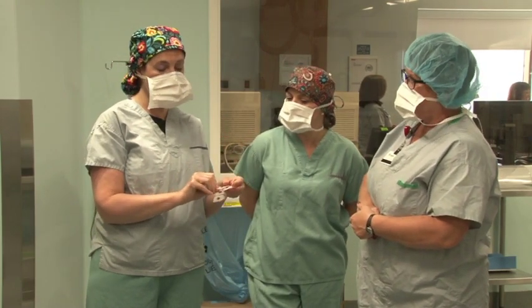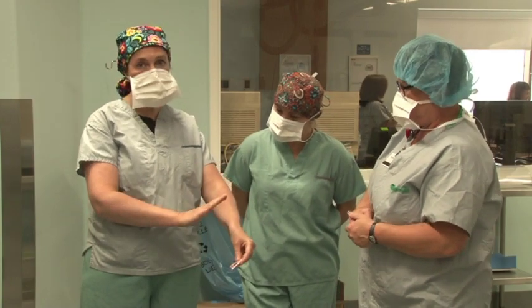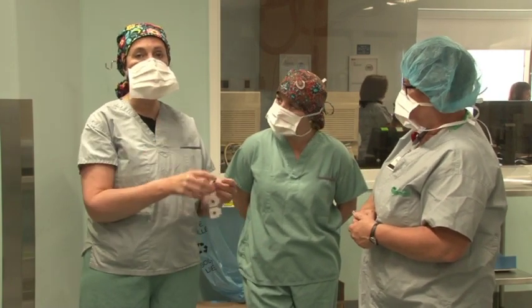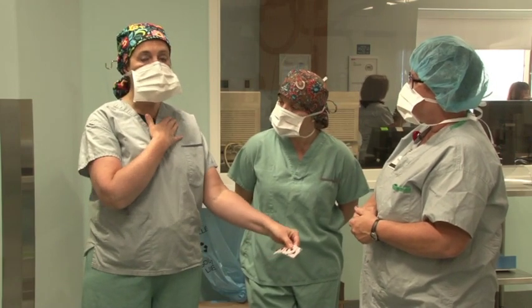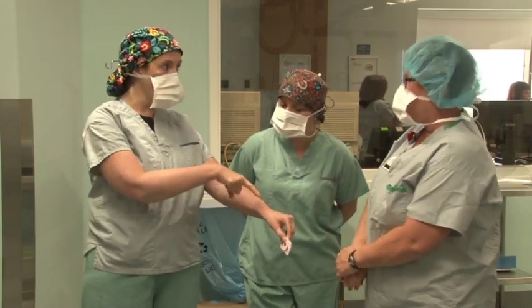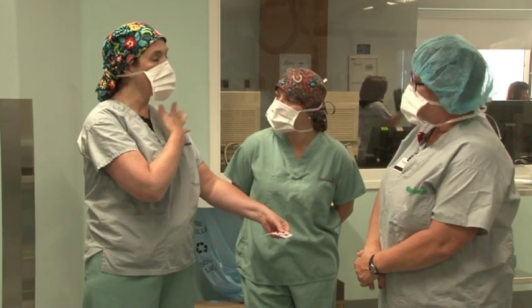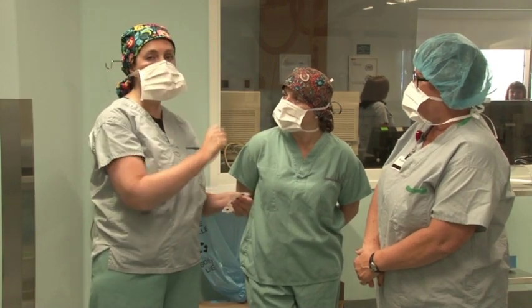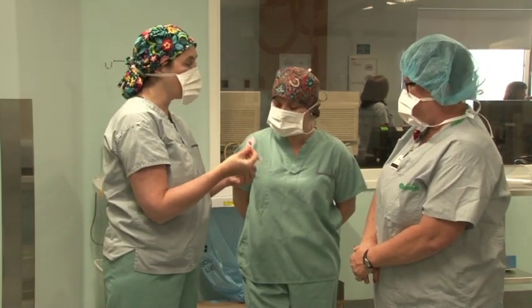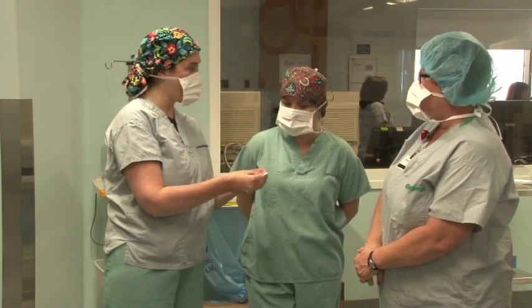It's also very important to put an IV in the arm, ideally on the side where you're going to have your implant. That helps us if we're having difficulty with access. Sometimes we put a little bit of contrast through the IV, and that will help make the subclavian glow from the contrast. We can see it, and it helps the physician with the access. That is a very important thing. If you can remember, please pass that on to your other staff.